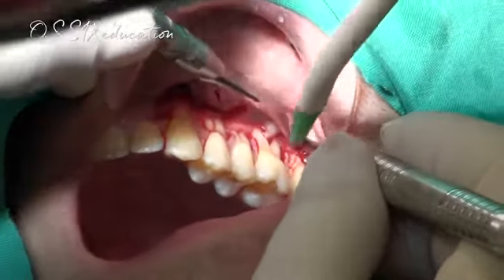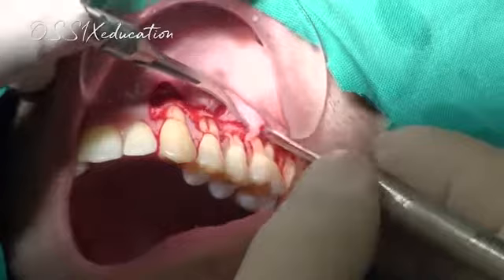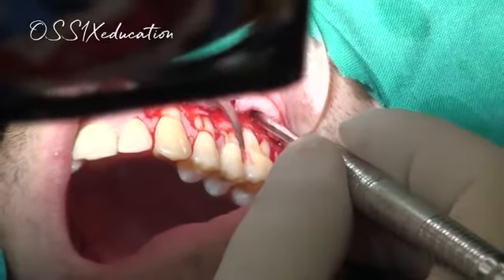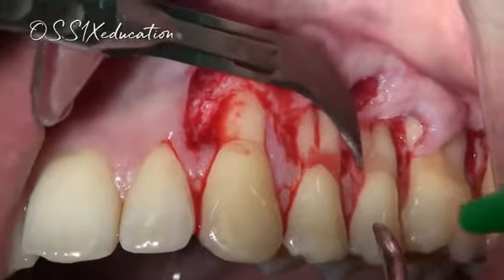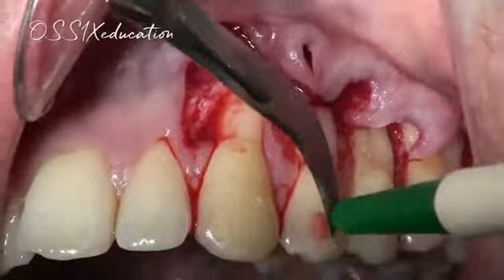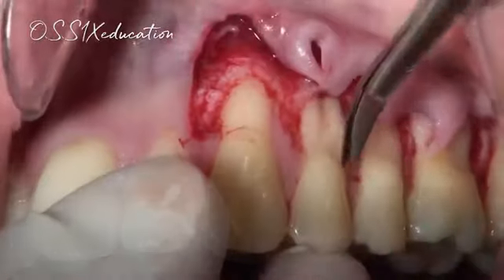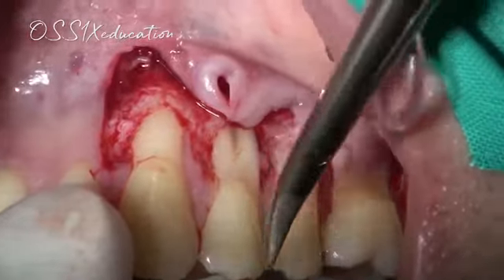The next step is to remove the epithelium from the papilla, so we will create the surgical papillas. I'll go from the distal to the mesial and do the so-called peeling. I mean, it can be considered as a peeling. So we now are de-epithelizing the papillae. I like to use the number 12 blade. It's very convenient for this.